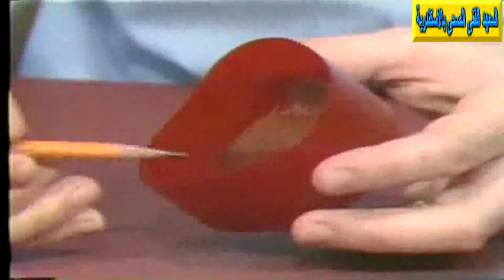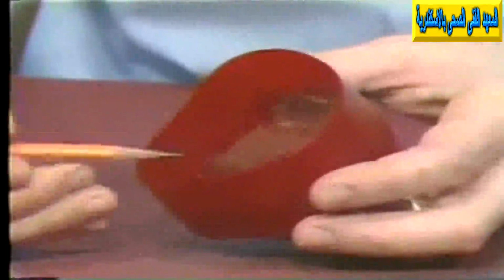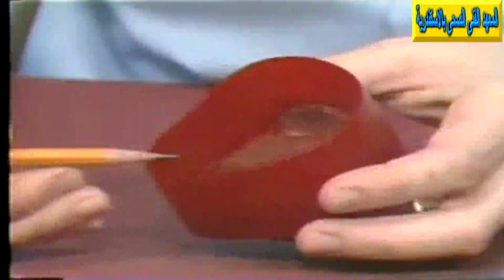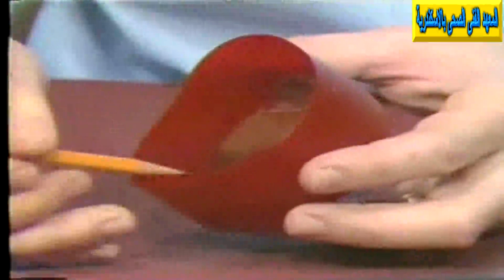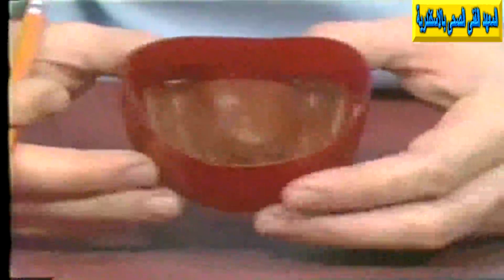And in this boxed impression, we'll pour the material on the vibrator into one of the areas of the boxed impression constantly. Keep an even flow from the spatula and let the material move around, pushing the air ahead of it. Instead of just adding a large amount of stone in the middle and vibrating it, we add it in one of the heel areas, for instance, and add all the material in that area. Let the stone flow and fill it up without trapping any air.